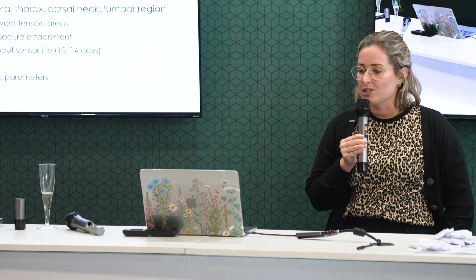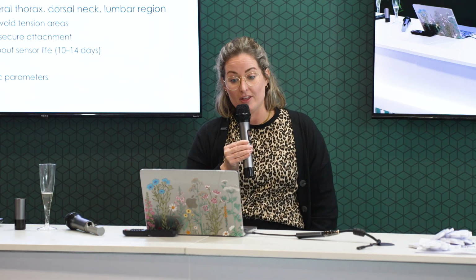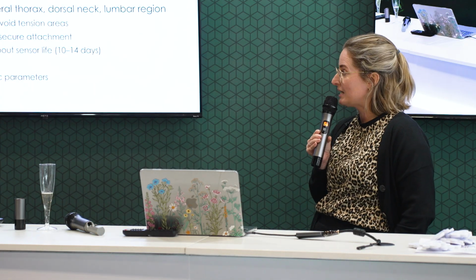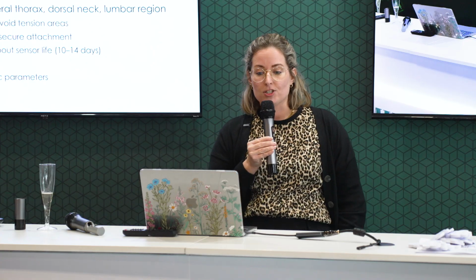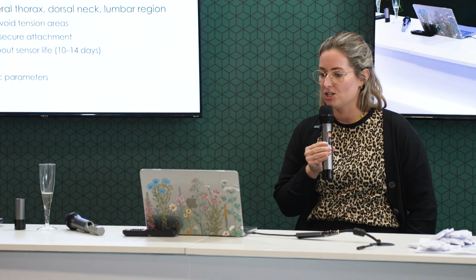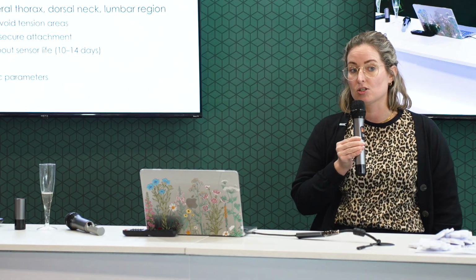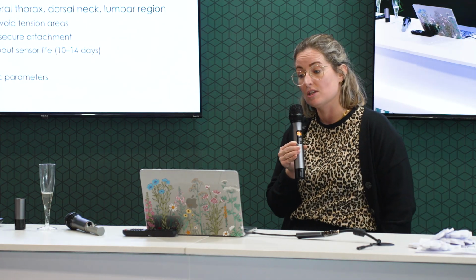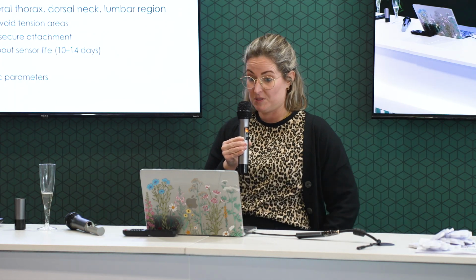What we will need to do is counsel our owners. So just let them know with these sensors that they are hopefully going to last about 10 to 14 days. Very occasionally we might lose one a little bit of time before, especially if it is a very, very active patient, and so just counselling them with regards to expectation. Other things at the time of placement that we can think about doing is to talk the owner through the app if this is new to them and they're not sure how to use it. And we can then go through and set specific parameters for that patient and that specific clinical scenario.